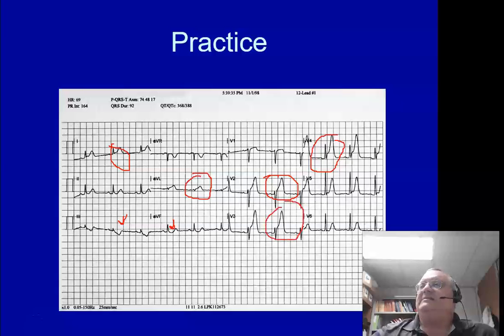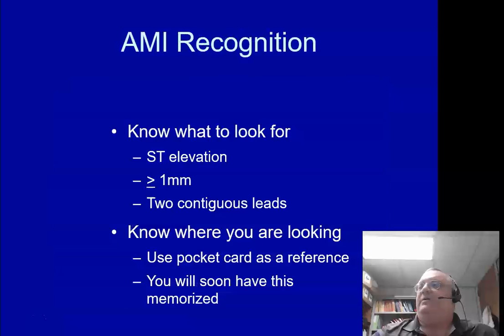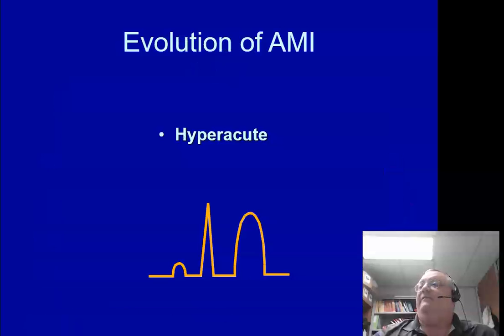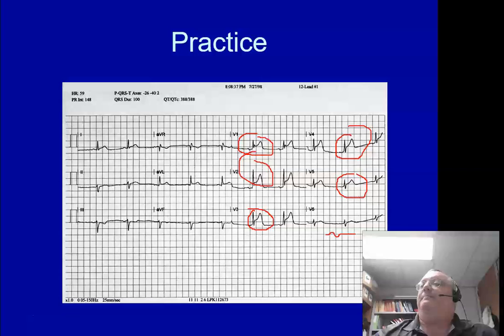So the good news is, guys, you can mix and match those words, anterior lateral MI, and stop and think about it. And we go back to here. Are they affected by the same artery? And again, remember, you only got 3 really to choose from. So if you got a really high block up here, is it possible to get all of this area here to be damaged? Absolutely. It is very, very possible for that to happen.